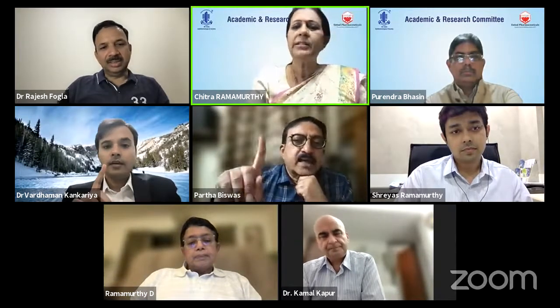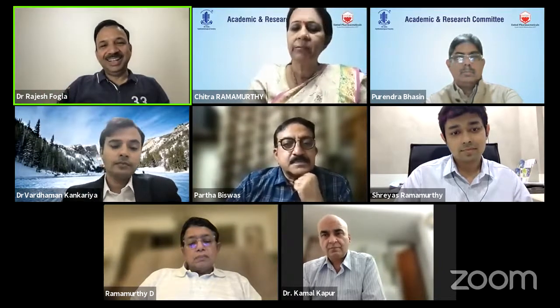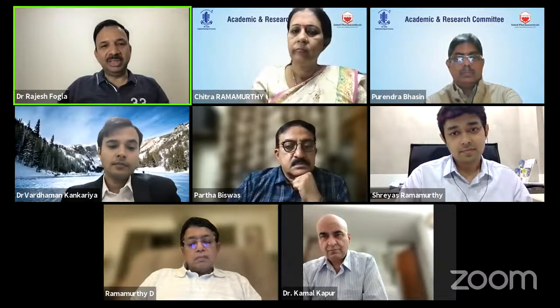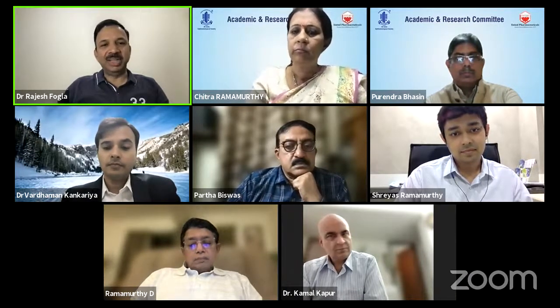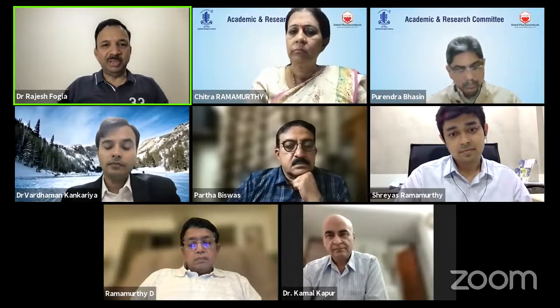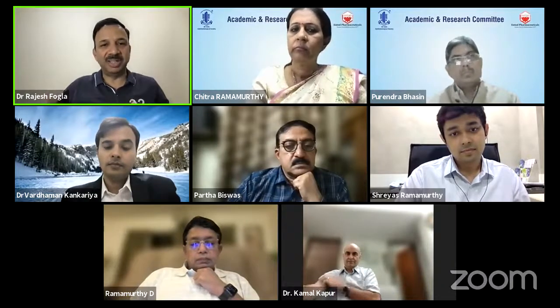Good. Can I make just one point here? Yes, Rajesh. I completely agree with what Dr. Ramamurthy has said. If you measure sulcus to sulcus, then the size of the lens should be exactly the diameter you have measured. Whereas the nomogram varies with the white to white and the anterior chamber depth. That means the deeper you are, the bigger the lens size becomes. So it takes that into consideration.